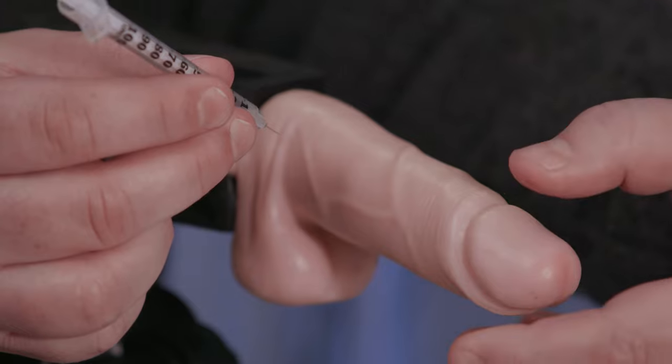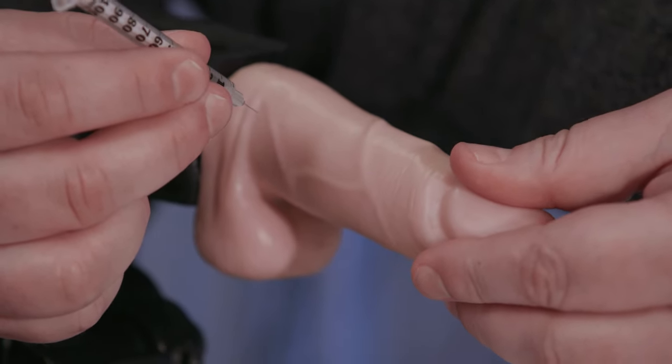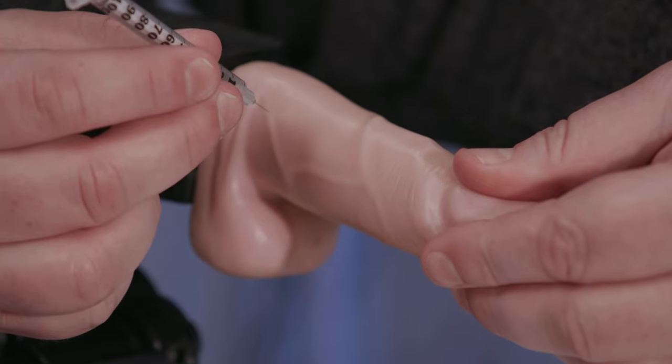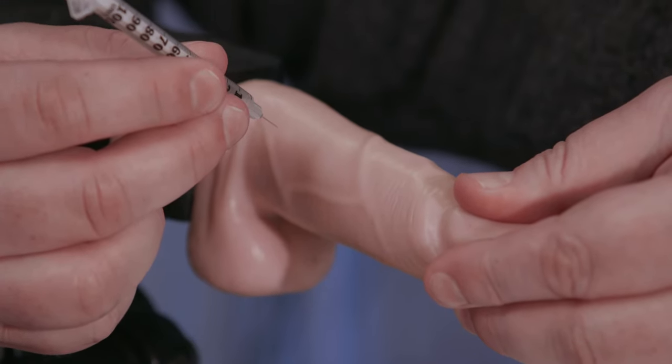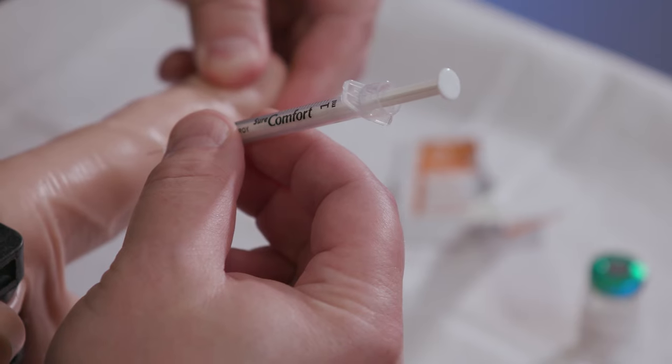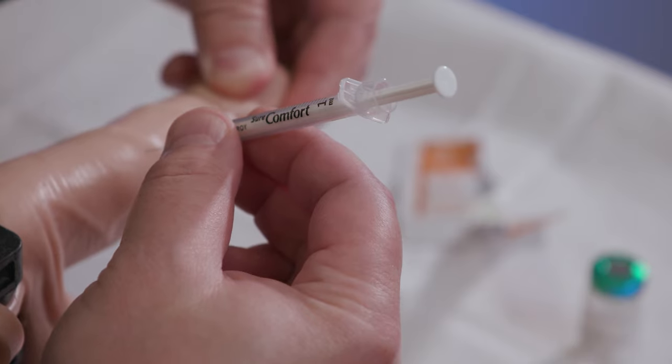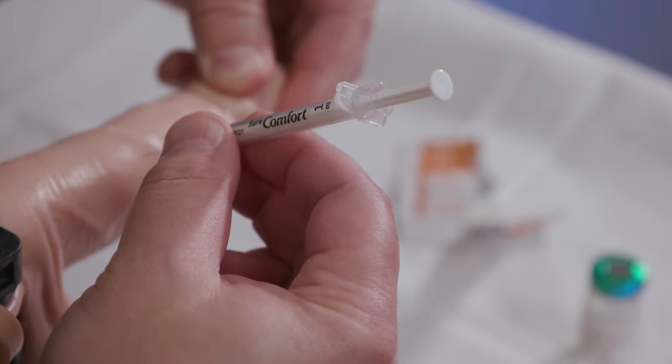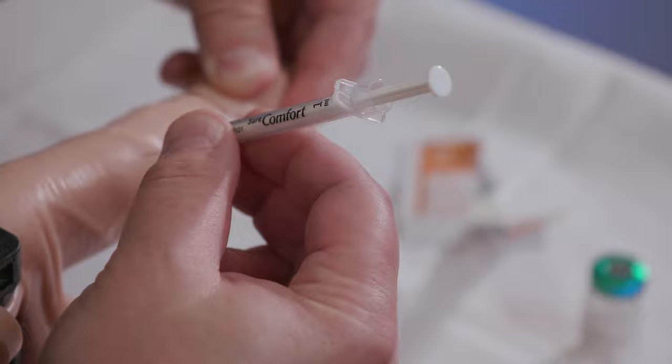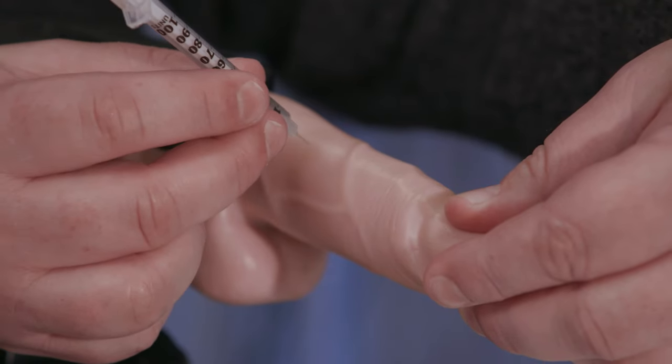If you have foreskin, pull it back. Once again, grasp the head of your penis and pull it straight out in front of you so it's fully stretched. This helps make sure the medication goes into the erectile tissue. Keep pulling on your penis from the time the needle goes into the shaft until it comes out. Don't twist it or you could inject into the wrong area.